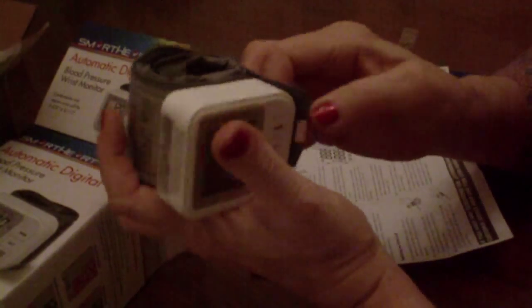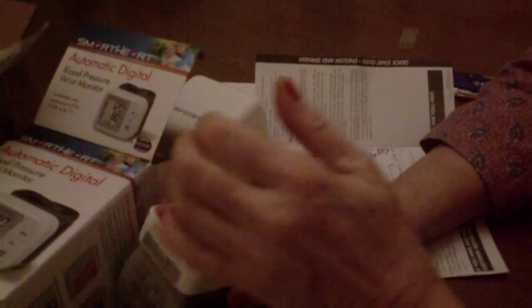147 over 96. That's better than it has been, although it's still really high. Of course, wrist monitors are not as accurate as the ones you put on your upper arm, because they're so far away from your heart.